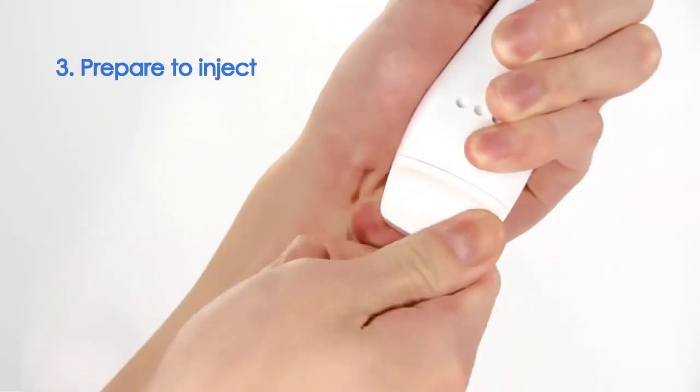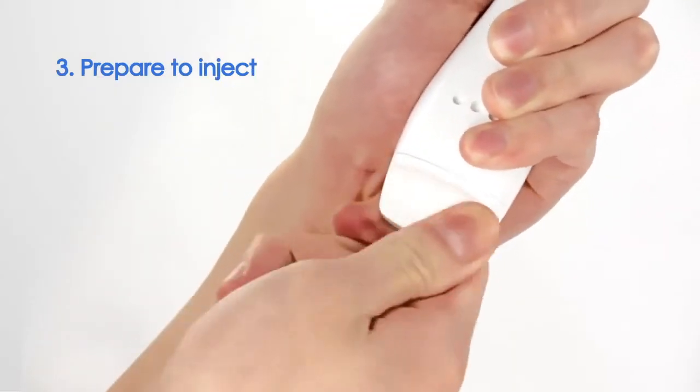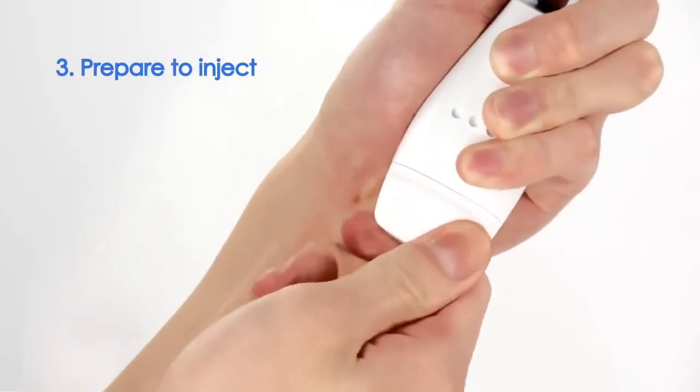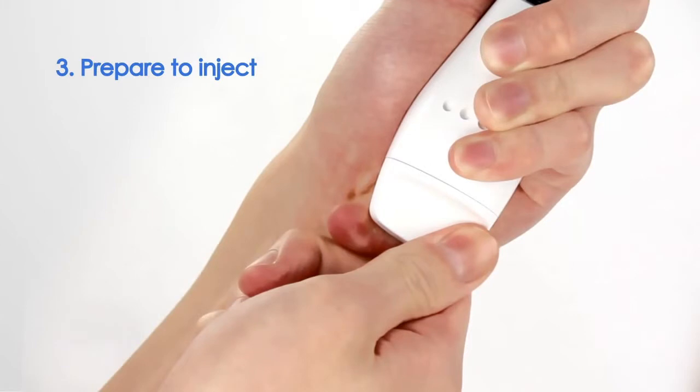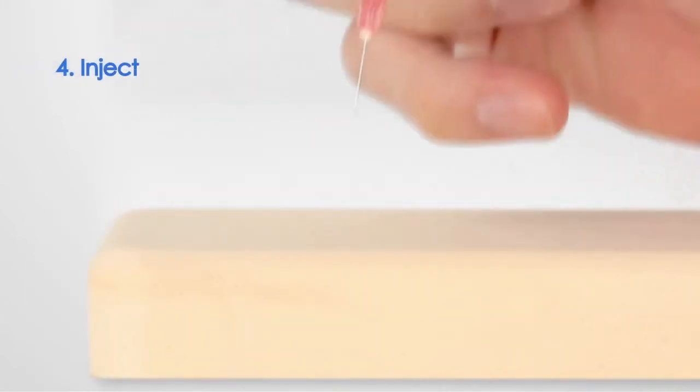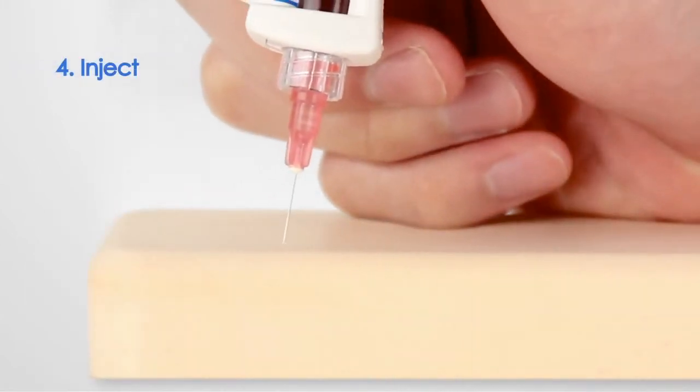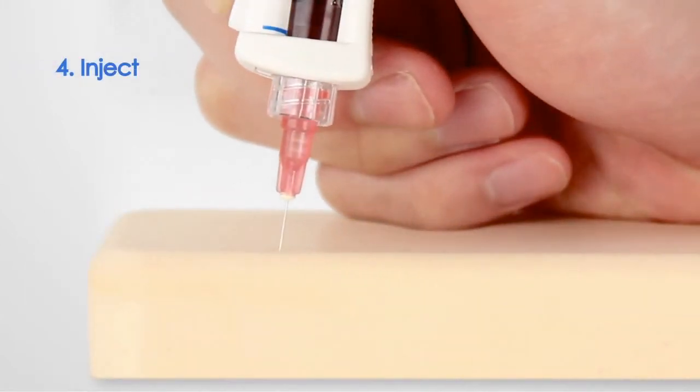Once primed, rewind the injector until it comes to a stop. To inject, insert the needle to the desired depth and press the Dose Activator button.